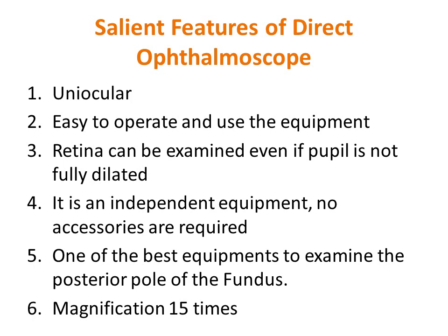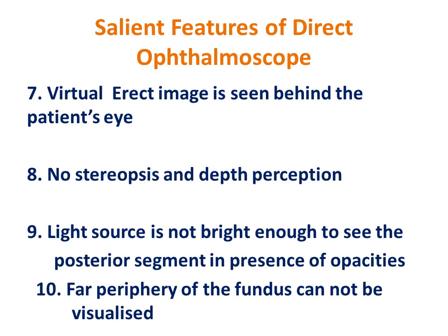The magnification being 15 times, it is easy for you to ascertain various abnormalities that could be present in an abnormal case. For example, in diabetic retinopathy, if there are exudates and hemorrhages, even very small microaneurysms can be easily visualized because of this 15 times magnification. A virtual erect image is seen behind the patient's fundus. This is another salient feature of this equipment. It is very easy to interpret as a virtual erect image is present. It's not an inverted image.